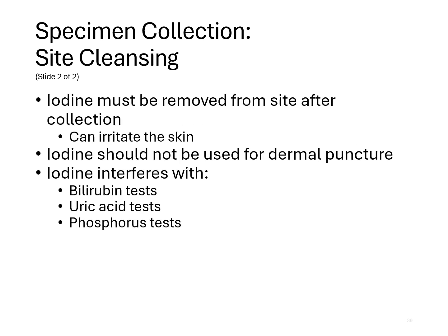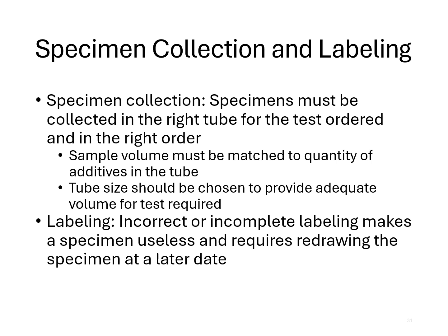Site cleansing again, so iodine must be removed from the site after collection because it can irritate the skin. Iodine should not be used for a dermal puncture, and it can interfere with bilirubin, uric acid, and phosphorus tests as well.